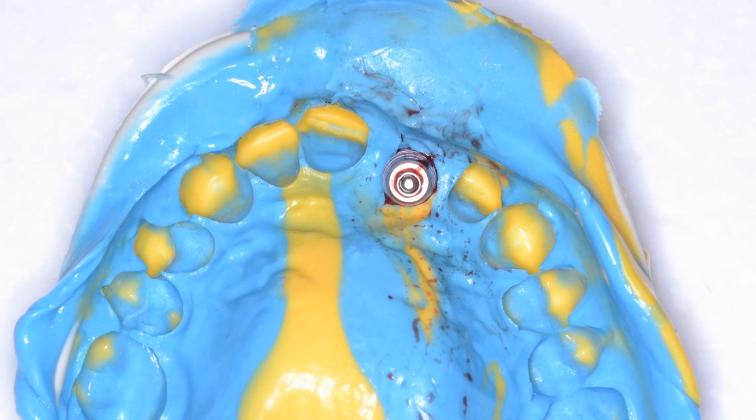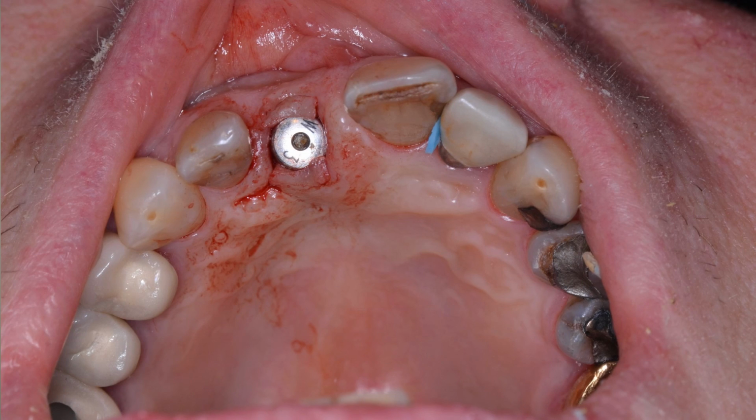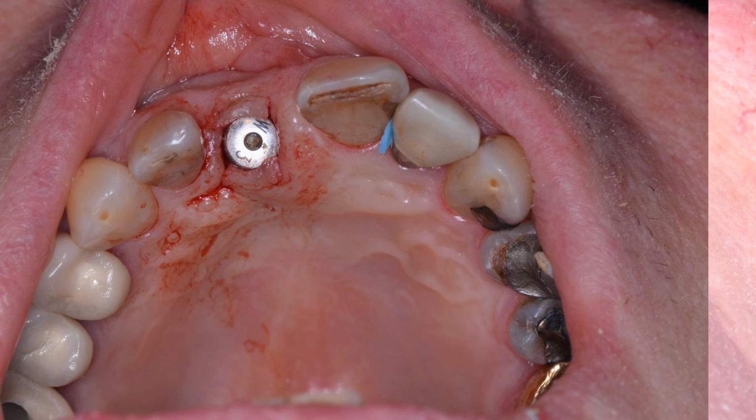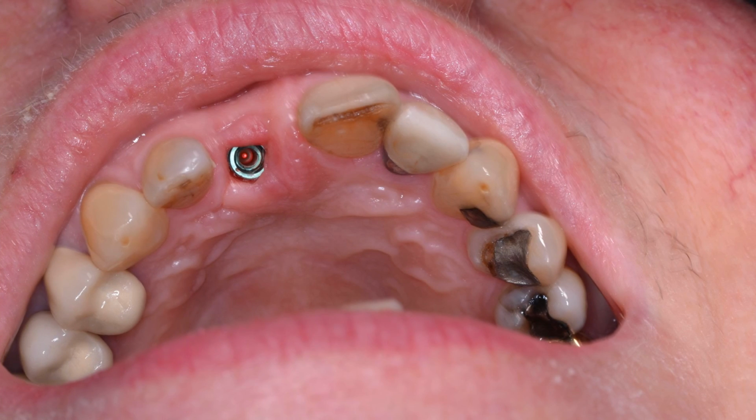Then it's just a matter of taking a fixture analog and adding that on, and basically putting a cover screw, or in this case a 3mm healing abutment, on for the patient. Taking a shade, sending that off to the lab. The patient comes back after a couple weeks, and we're basically ready to insert this case. So you can see that the tissue has grown in and around that healing abutment for the patient.